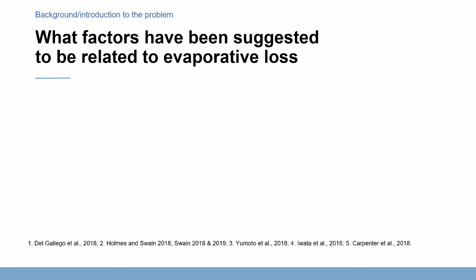And so a lot of other people began to think about this and began to investigate different factors within an embryo culture system that might contribute to this change in osmolality that is seen when embryos and culture media are cultured in a non-humidified environment. And perhaps not surprisingly, people would perform the so-called one factor at a time approach. And there were a number of abstracts and a few papers that came out of these investigations.